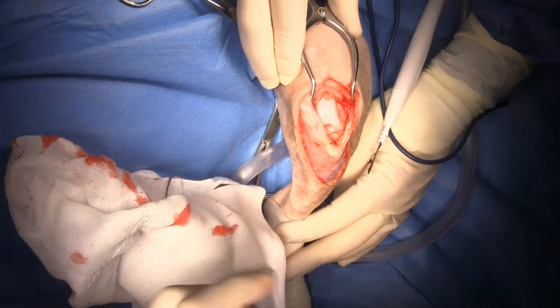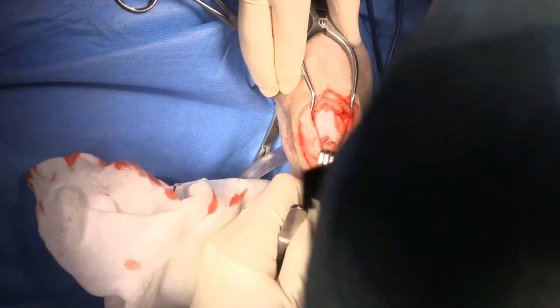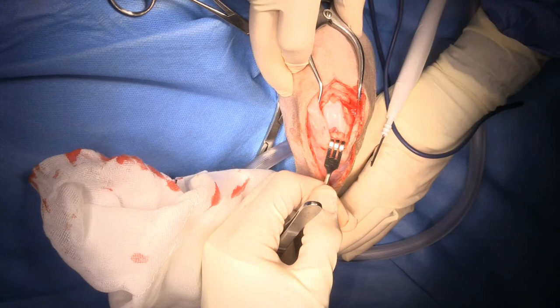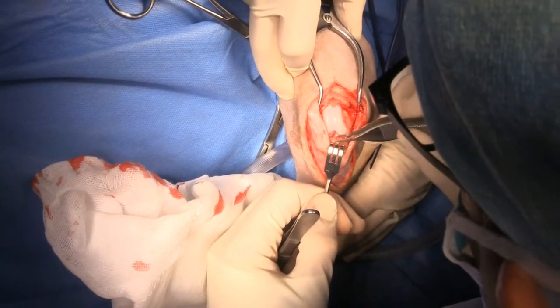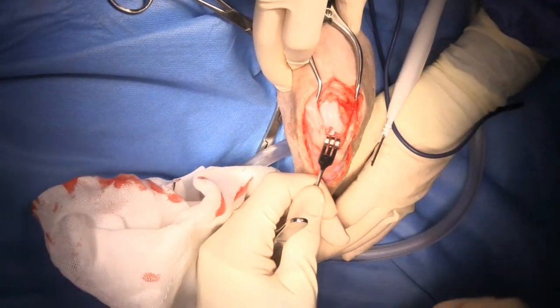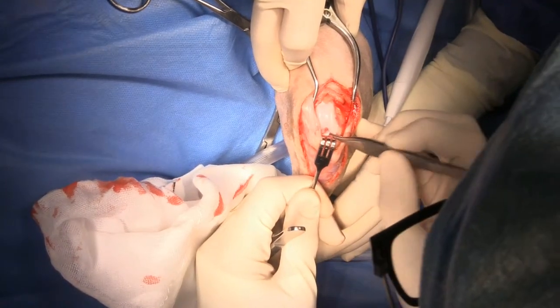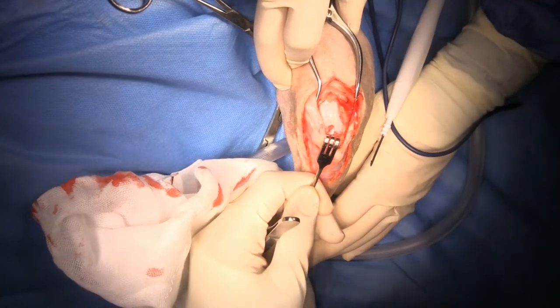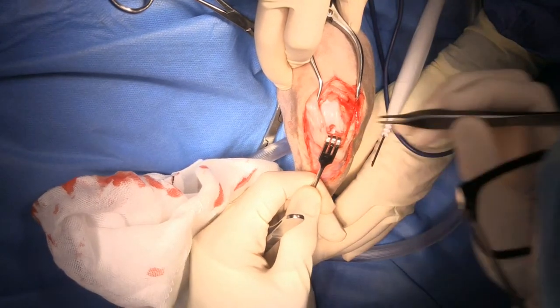Next we're going to use a Senn retractor to pull the infrapatellar fat pad out of the way, and then we're looking inside the joint to assess the cruciate ligament. That's the cruciate ligament sitting right there - that's the cranial cruciate and that's the caudal cruciate back there. I'm very confident that that's intact.